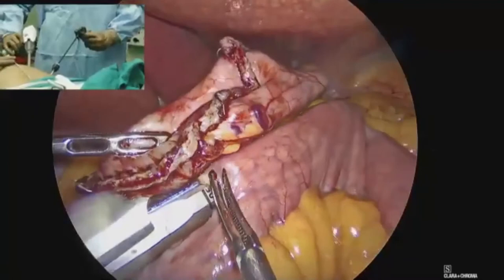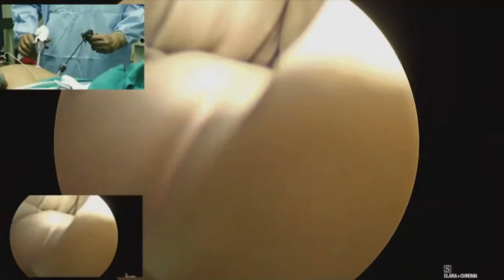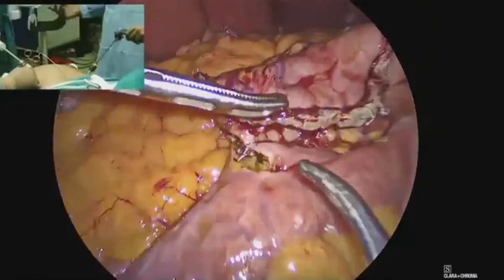So that's a posterior gastrointestinal anastomosis. We'll clean our camera once. I would never go ahead and do a procedure if the camera is not clean. So we clean it once so that I can see and demonstrate better. We are again inside. And now I can just repair this and do an endoscopy for all of us to see how the internal anatomy looks.